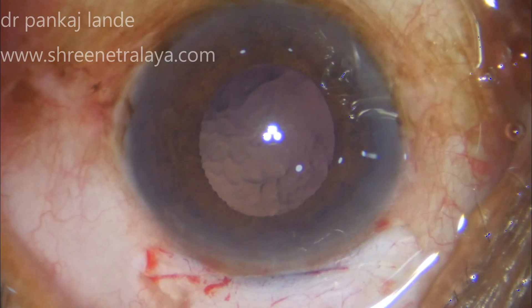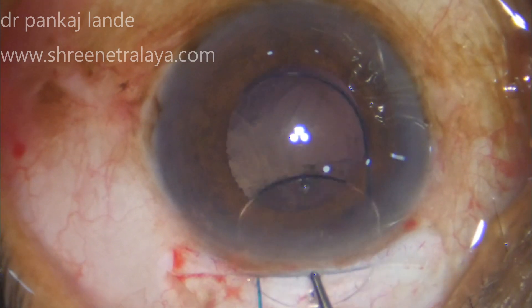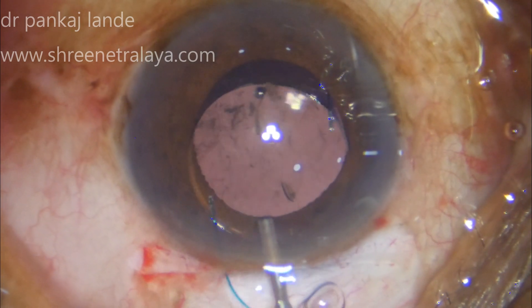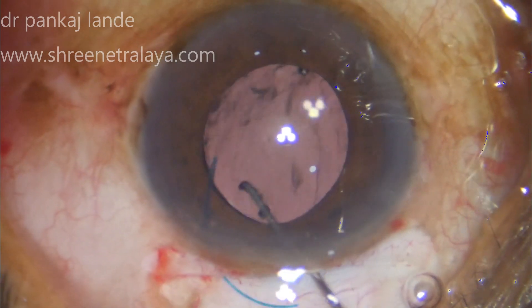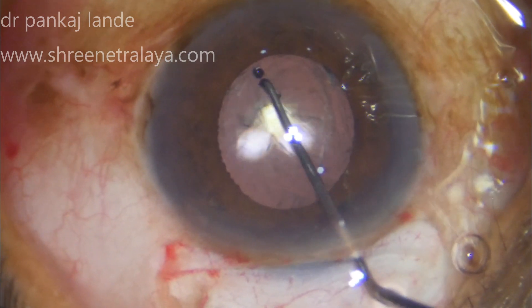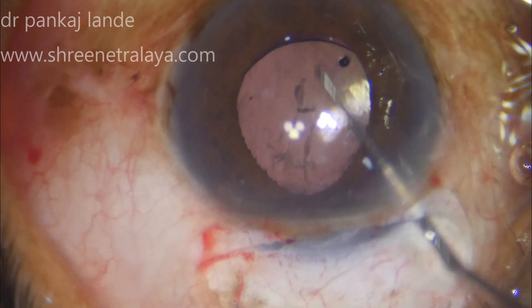The anterior chamber is optimally filled with viscoelastic material, followed by implantation of a rigid 3-piece IOL in the bag. The first haptic goes directly into the bag and the trailing haptic is dialed in with the help of a dialer. The IOL is then rotated in the capsular bag to confirm the position of both haptics.